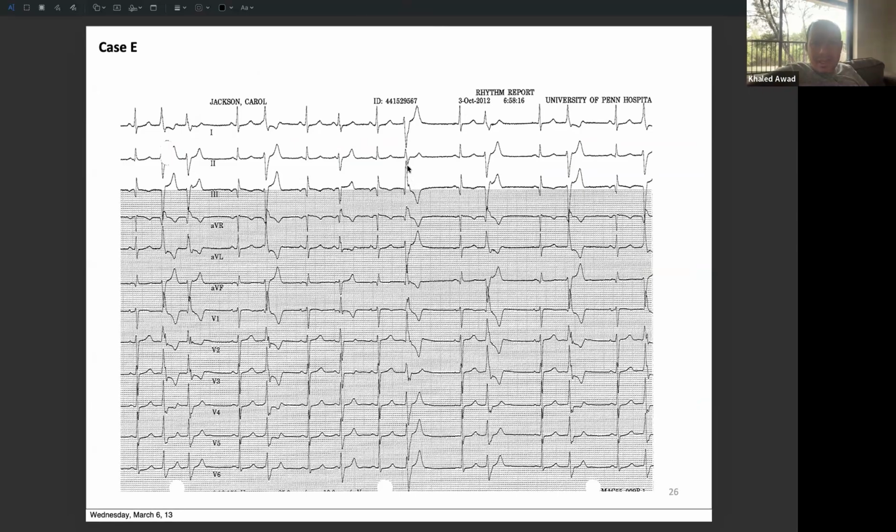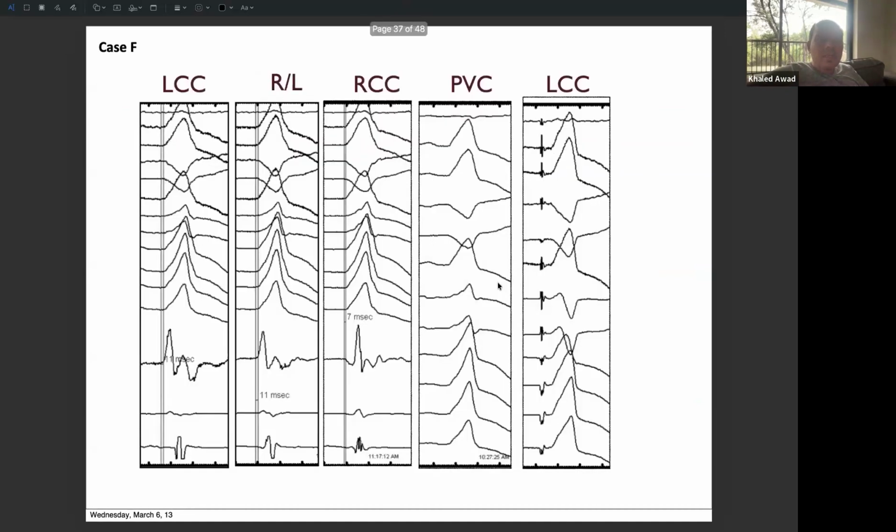And what I see here was more telling to me of something along the lines of the superiorly directed one. It helps. It probably is papillary muscle. Now let's look at more examples of those morphologies and things that present exceptions. Maybe they're not necessarily always along the lines of these rules.